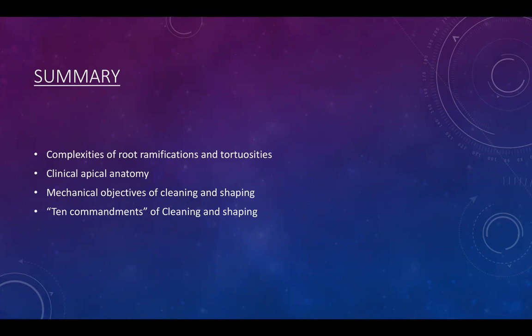So there might be limitations with that. I find some brands are better than others for that. Sometimes when we have a curved canal, we might end up losing some of the length. And when we're trying to get the cone, we see that we're short and we actually have to go back again and use our files.